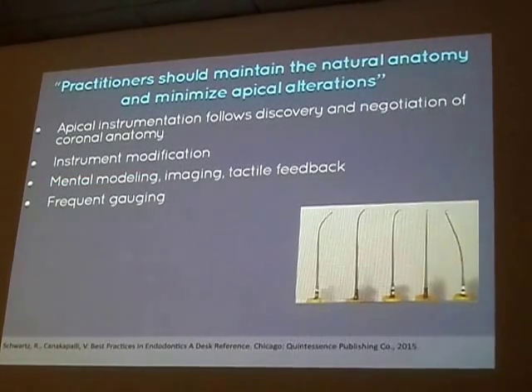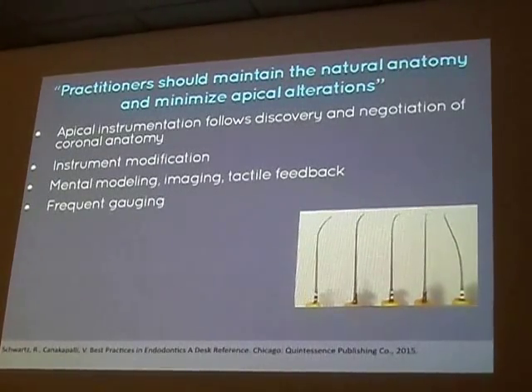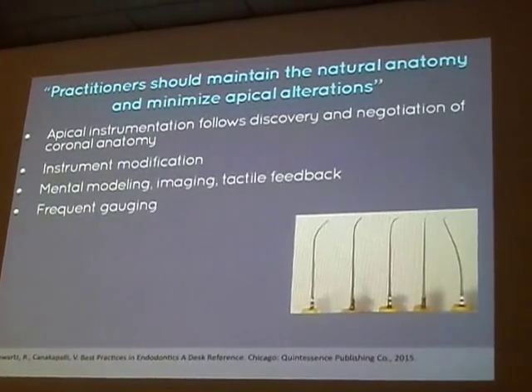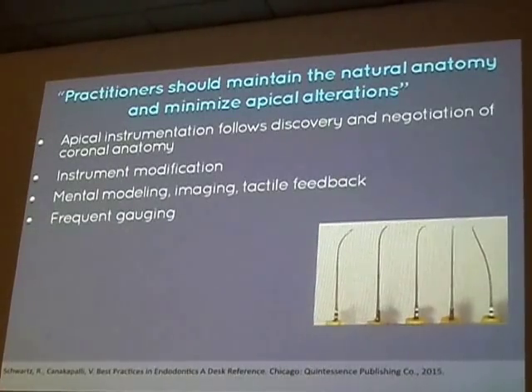And then frequent gauging. So throughout each successive instrumentation, again, going back with your smaller pre-curved files in order to understand the actual apical anatomy.